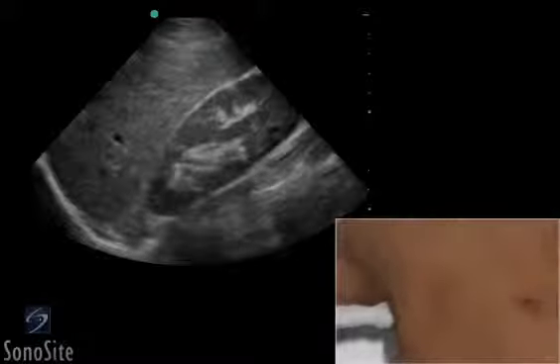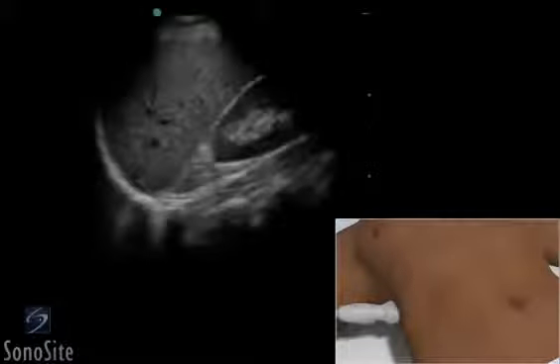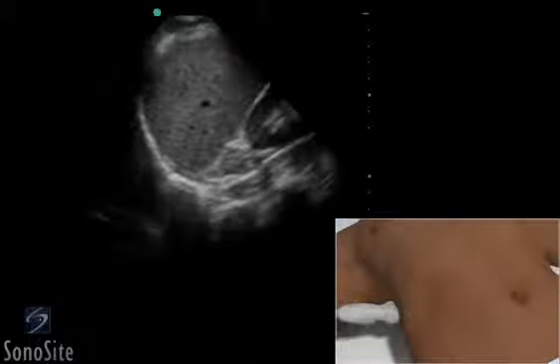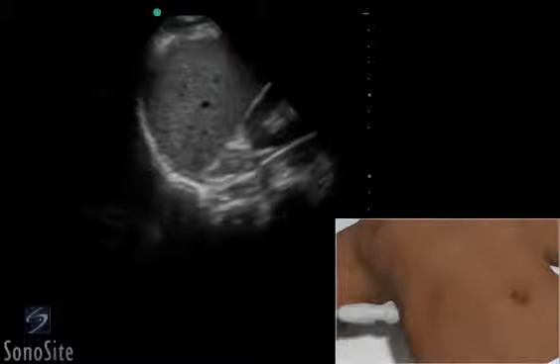If it is difficult to visualize the hepatorenal recess, a deep inspiration will move the diaphragm and other structures in this area down and below the ribs for easier access.